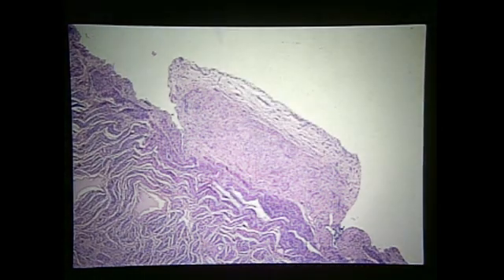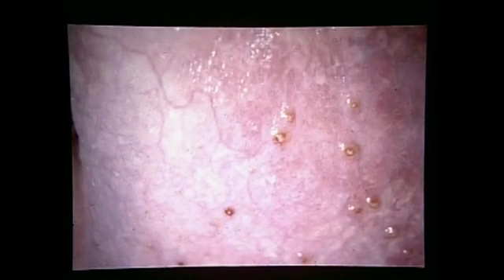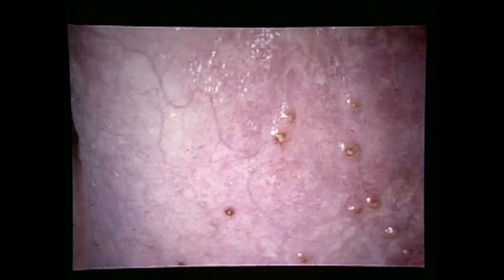Again, other considerations need to be added to the differential diagnosis. Microscopically, it is composed of macrophages, every so often giant cells, and a decent number of fibroblasts. Sterile granulomas associated with pleura of the lung. I've seen it also associated with the serosal surface of abdominal organs, including the uterus. A couple of examples of primary skin tumor. The most popular is known as equine sarcoid. It has a couple of preferential sites, such as the head or the leg.